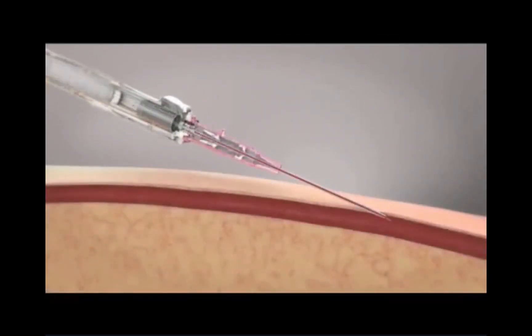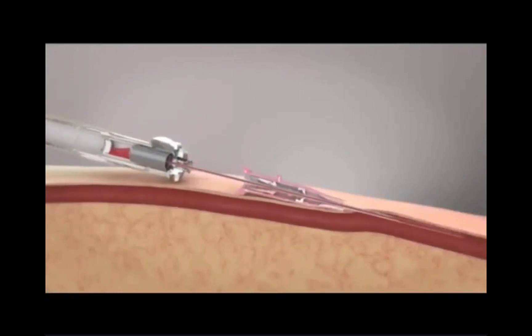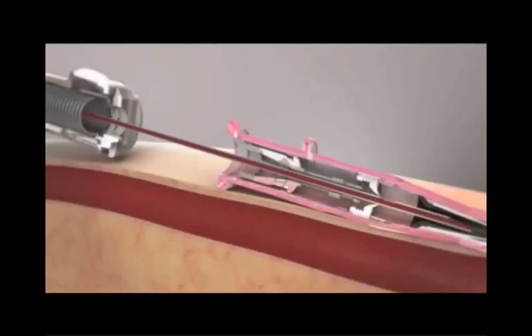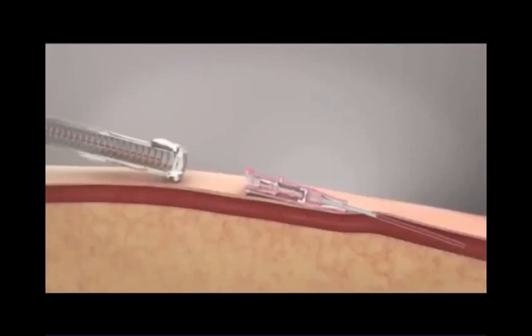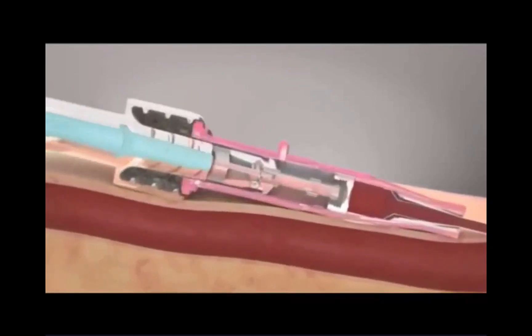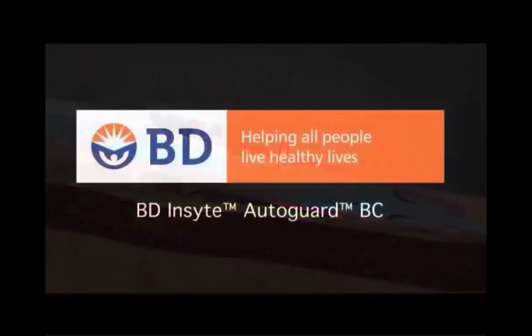The vein is penetrated and blood return is observed along the catheter shaft and continuing to the flash chamber. The catheter is then advanced and the button is pushed, retracting the needle into the barrel, where the needle is fully encapsulated. As the needle retracts, the blood control septum closes to stop blood from flowing out of the catheter hub. When a luer connection is made, the septum is permanently opened, allowing flow into and out of the catheter.